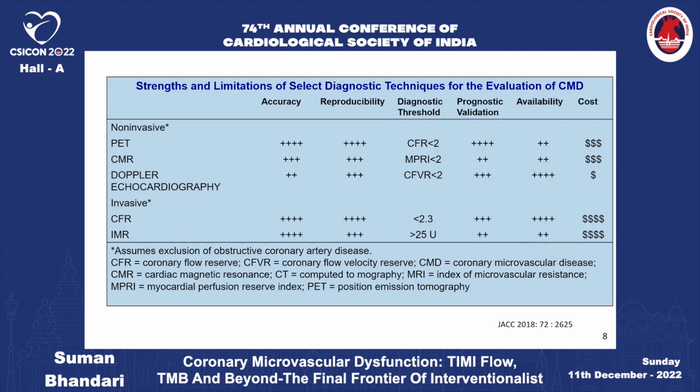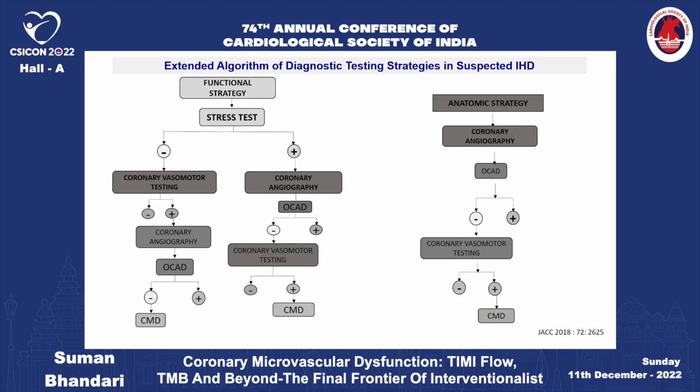So these are the strengths and limitations of special diagnostic techniques to evaluate CMD. Non-invasive, the PET has a very high accuracy and reproducibility, but has a significant cost. The CMR and Doppler echocardiography, especially for the LAD, can be assessed, with good diagnostic threshold and prognostic validation. The invasive ones are coronary flow reserve and IMR, and they have to be assessed invasively.